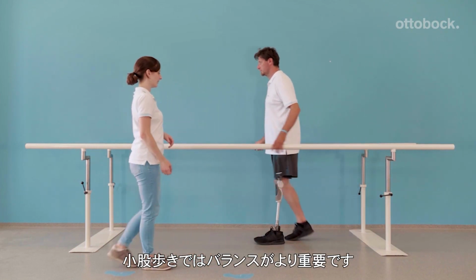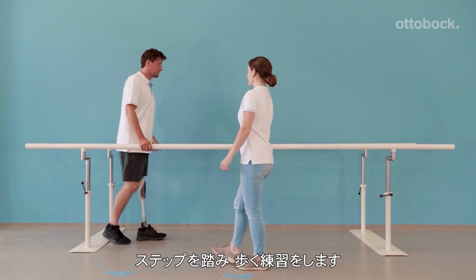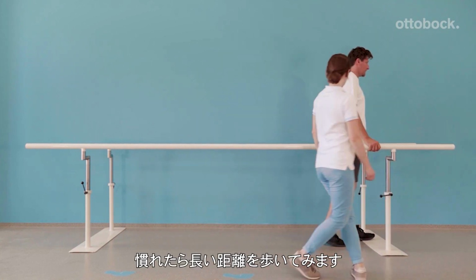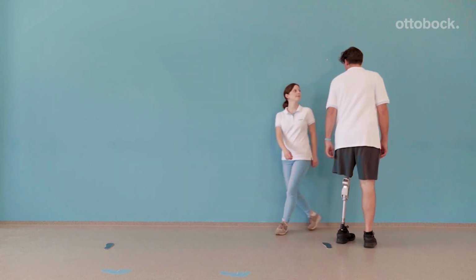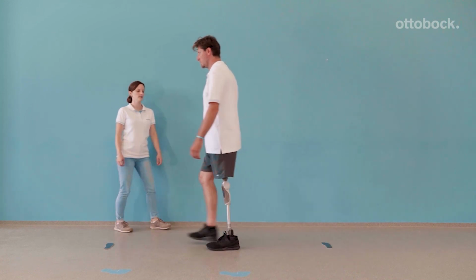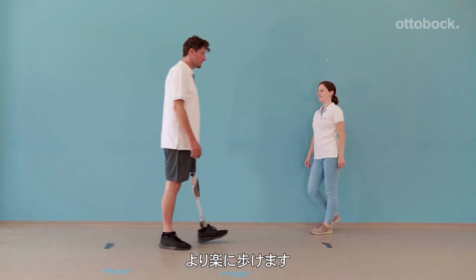Walking with small steps requires a high level of balance. To practice stance release, try to take as many steps as possible while using the least amount of power, and increase the number of steps with proper stance release over a defined distance. Due to his good walking technique, he can move with significantly lower effort in his daily life.